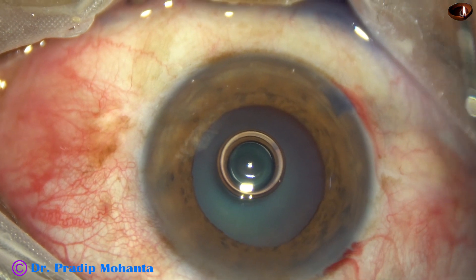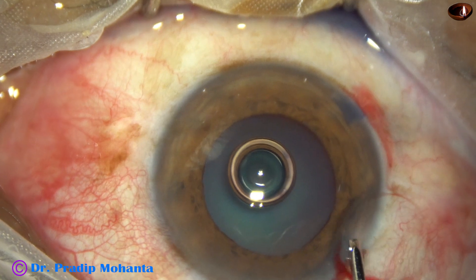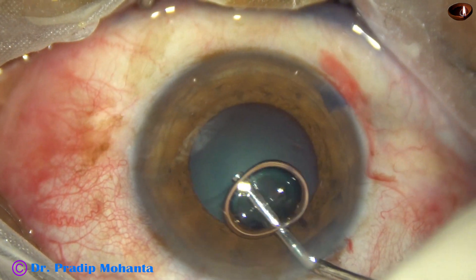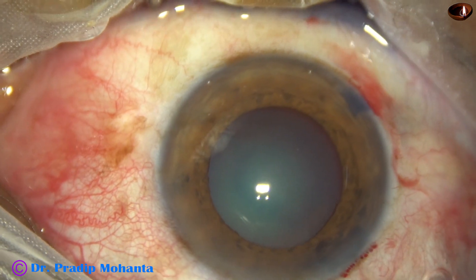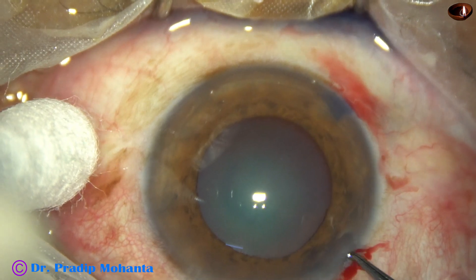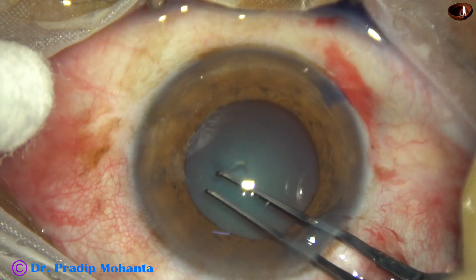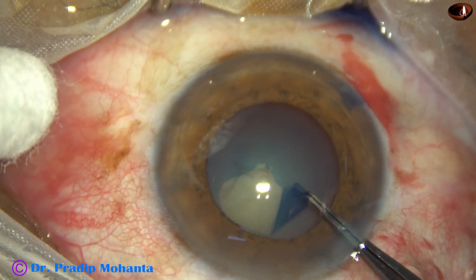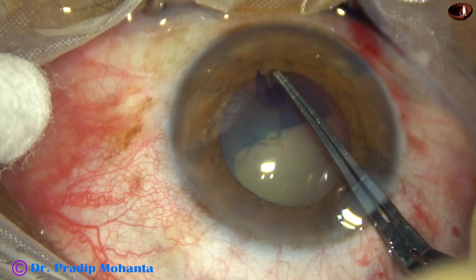The pupil which was 4 millimeters has become about 5 millimeters. And after applying visco, the pupil dilates to about 5.5 millimeters. So we are going to get an adequate-sized rhexis — about 5.25 millimeters.